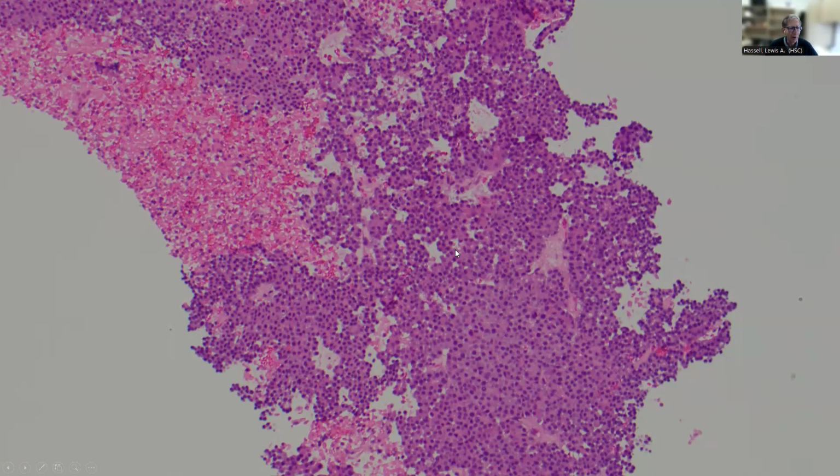So this is something that we might see with a neuroendocrine tumor. We might see it with solid pseudopapillary tumors arising in the pancreas, or possibly even an acinar-based tumor as well. So that would form initially the main considerations. But along with that, because the nuclei seem fairly uniform and there's abundant amphophilic cytoplasm, we might think about adrenal neuroendocrine lesions such as paraganglioma or even an adrenal adenoma at times.